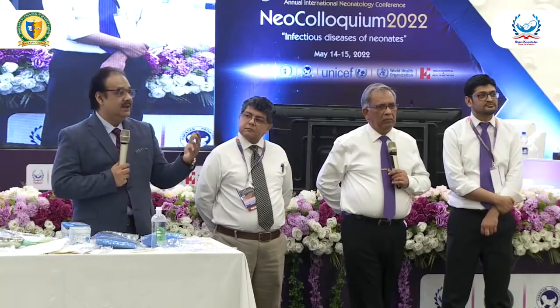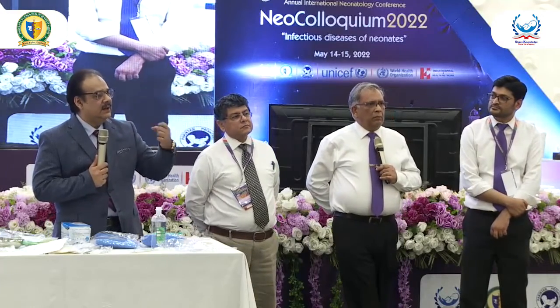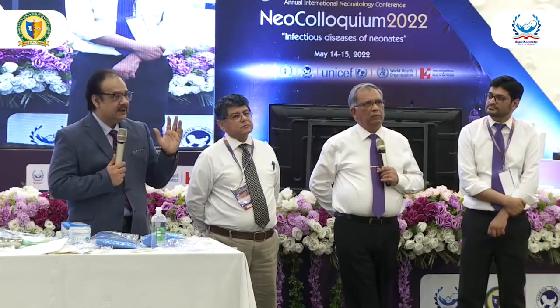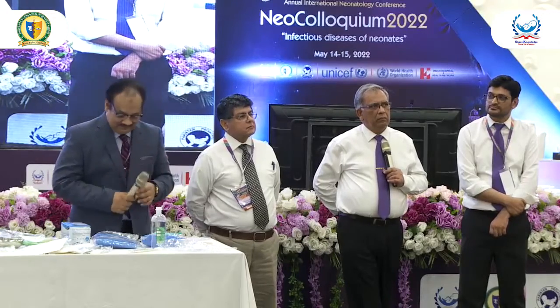For 3 months, 6 months. And regarding the safety rules, a PICC line is not recommended for more than 3 to 4 weeks by the distributors or manufacturers. So we never use the Portacath for those things. If, let's say, I had a baby on ECMO, the extracorporeal membrane oxygenation, we just put a Broviac. Okay, Broviac is more suitable. Thank you, sir.